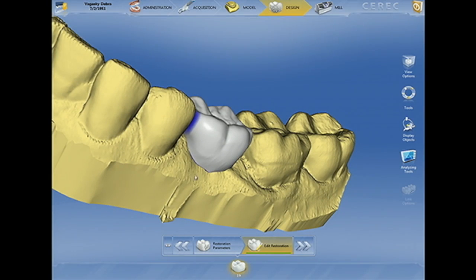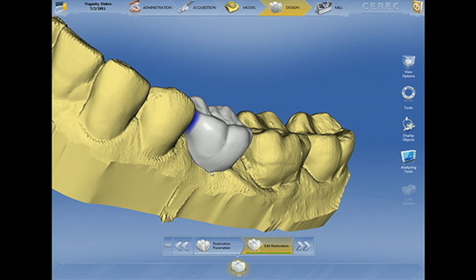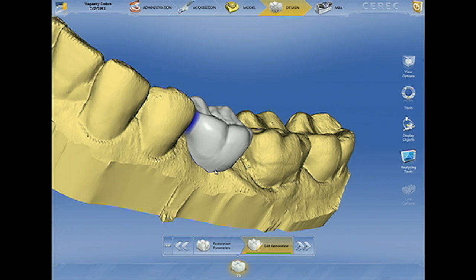The transition from an implant to the full contour of the natural tooth that we're trying to restore requires that we place an implant at the appropriate depth. So if we start with the restoration that has the full contour of the natural tooth, then we can work backwards and really understand what depth of implant placement is most appropriate in order to have a result like this.